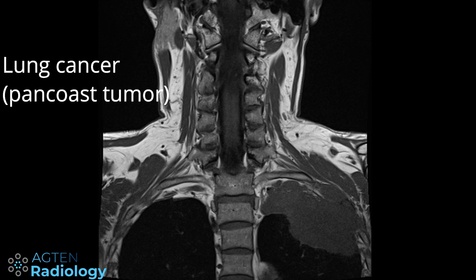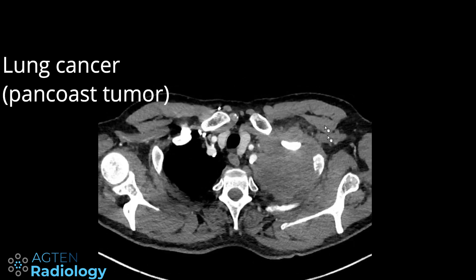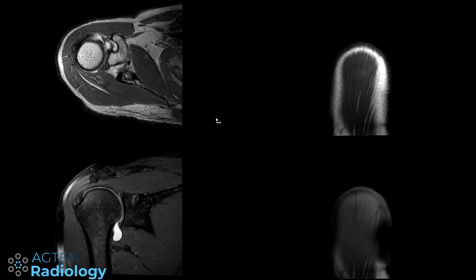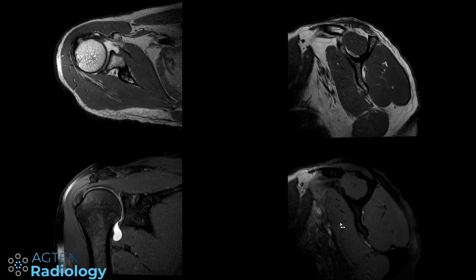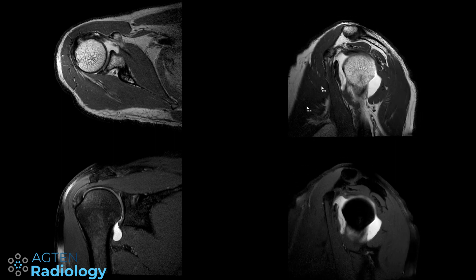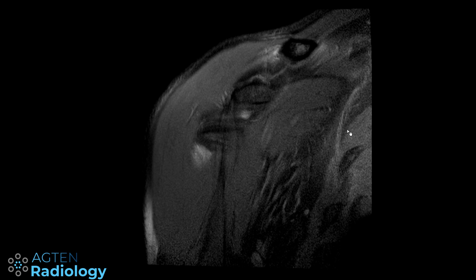Let me show you the corresponding CT in this case, which is quite remarkable — all this tumor. Incidental findings in joints are also frequently encountered, especially in the shoulder. Here we can see a shoulder MRI where you look at all your typical structures, scroll through, and nothing really jumps out at your eye.